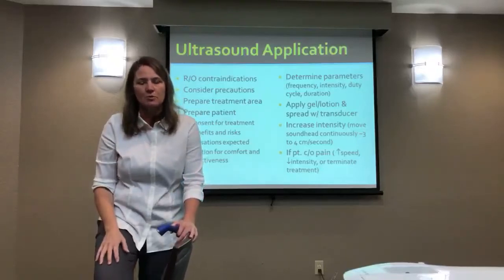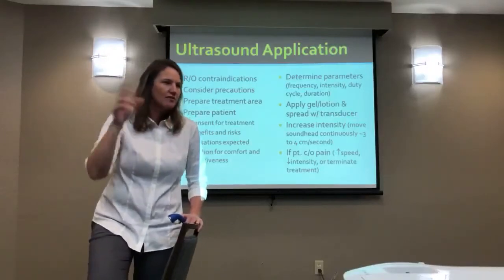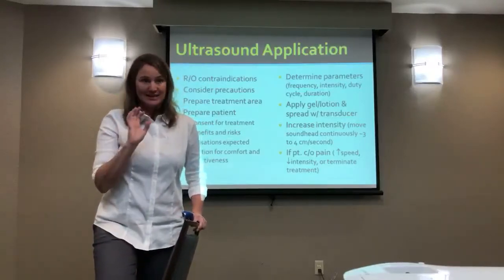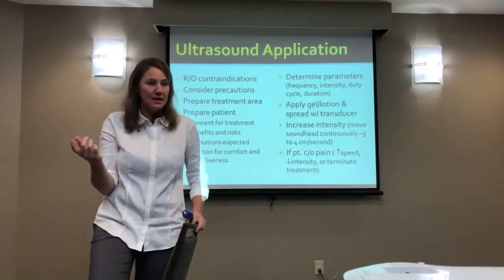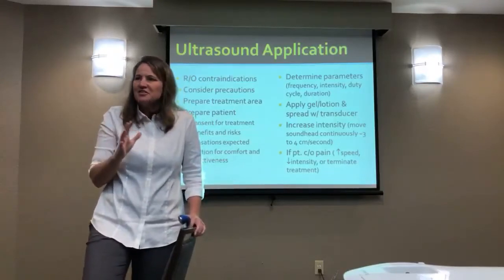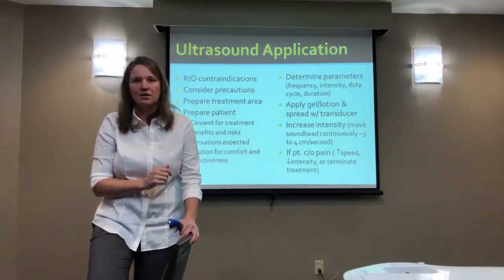I've had so many therapists call me in and say, hey, can you help me set this machine up? And I can't figure out how to get it onto whatever we just did. It's usually E-stim, because they're more complicated to set up. But I don't like that. I'm like, let's not have this discussion in front of the patient, because especially if it takes me a minute, well, hold on, let me remember. Okay, yeah, we have to go to this other field. It just decreases their confidence and their sense of safety, and their caregivers'. So try to do those things outside of their view.